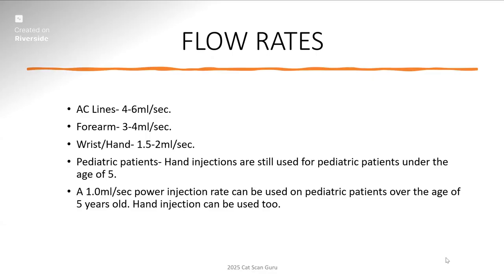So I always strongly recommend a hand injection because we do 1 cc per pound. So if the patient weighs 10 pounds, that's 10 cc's of contrast. So that's my strong recommendation.